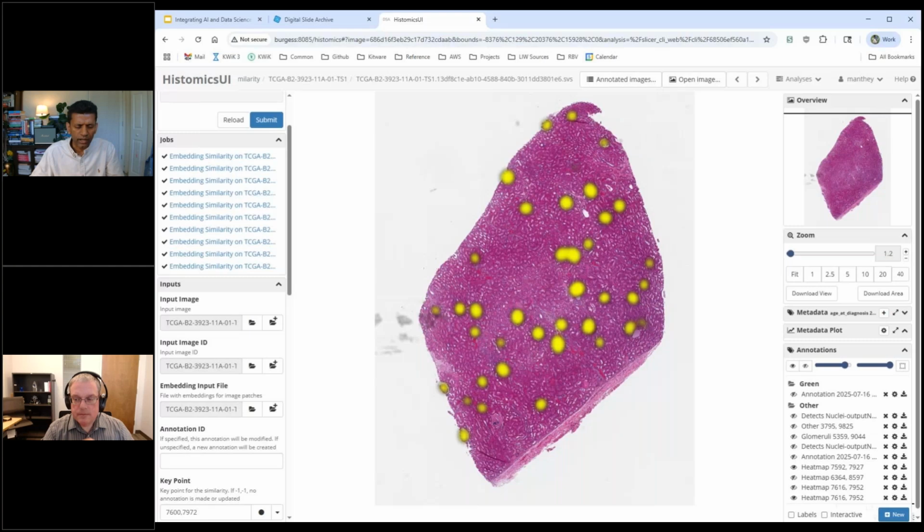Yeah, one thing I would like to add is that DICOM definitely is very important for us, not just for this particular effort, but for other efforts as well. So that's something we're definitely keeping an eye on and working on as we get funding, as David mentioned.